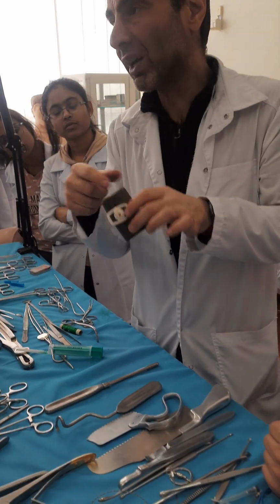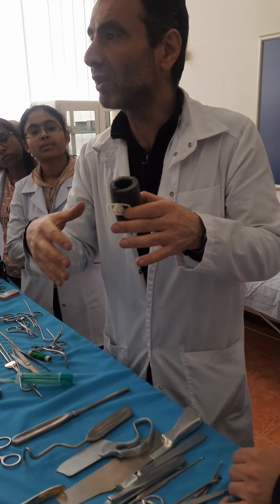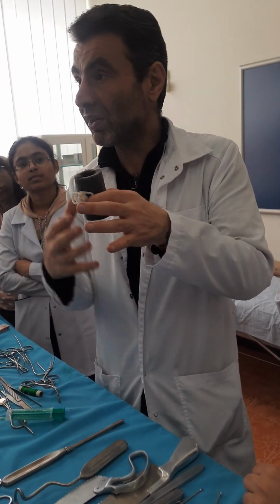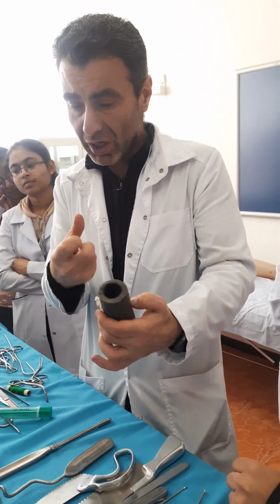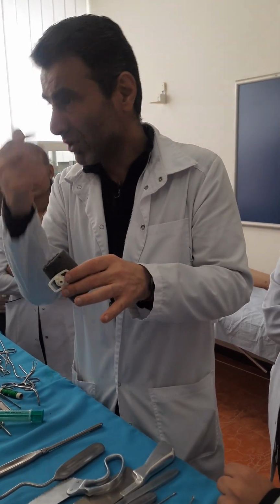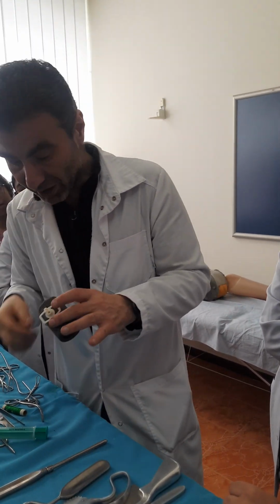Sometimes it has an internal enlarged portion. We inject liquid or we inject air, and it is opened, expanded, and fixed inside the trachea to prevent the dislocation. Do you understand? Yes. It is connected with an injector. You inject the liquid, you expand the balloon, which is connected with the tube, and it makes fixation of it inside the lumen of the trachea.